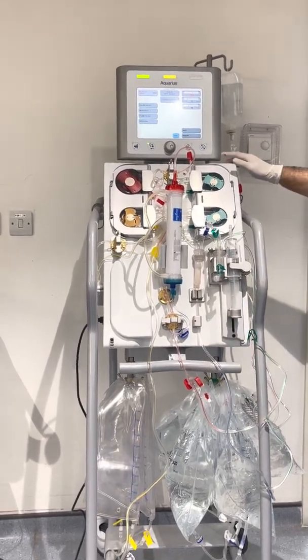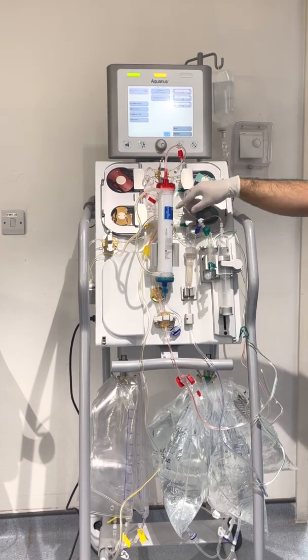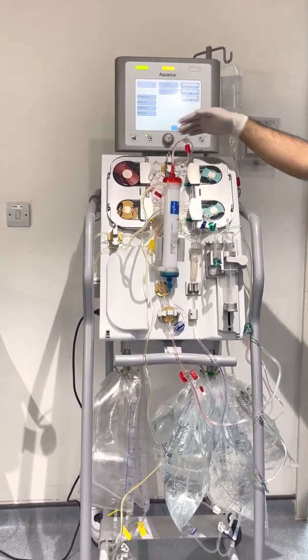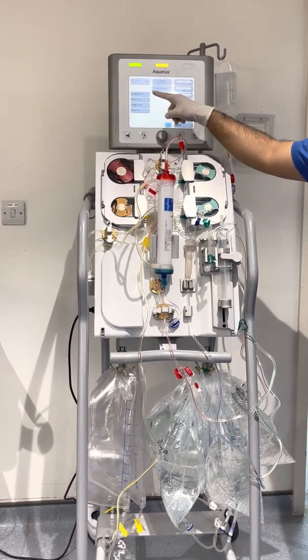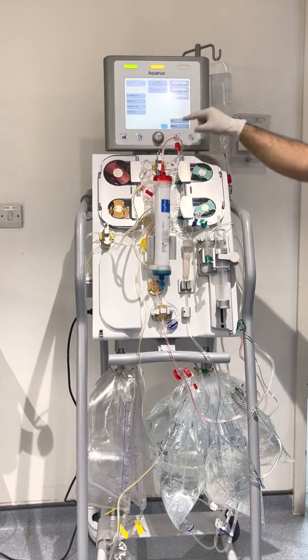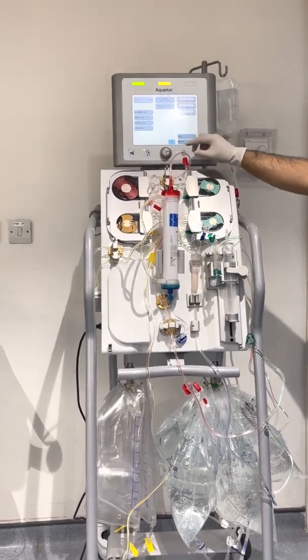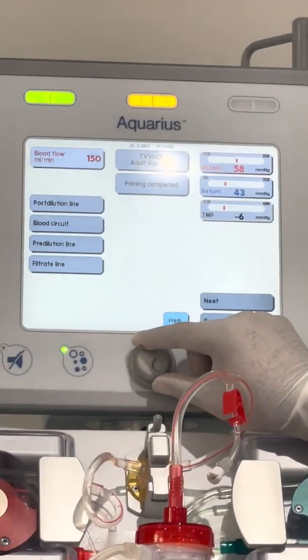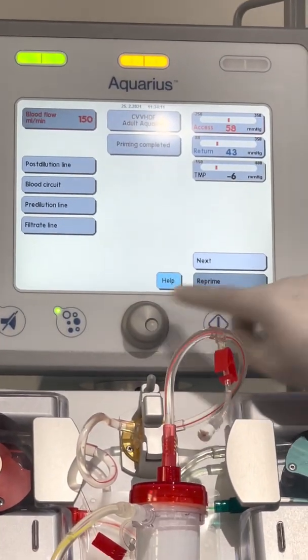So that's it. If you see some lines here, you just have to re-prime. You can choose which line you are going to re-prime again. For example, if you see some air on this, you can choose blood circuit. If you see pre-dilution, you just choose whatever you want. Okay, so now it's all good. So you can put it to the next part.